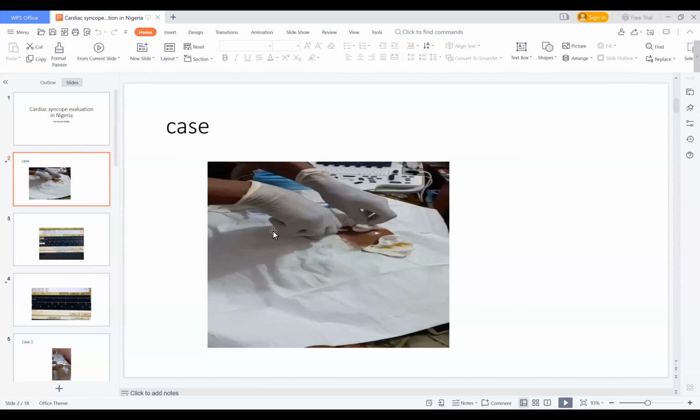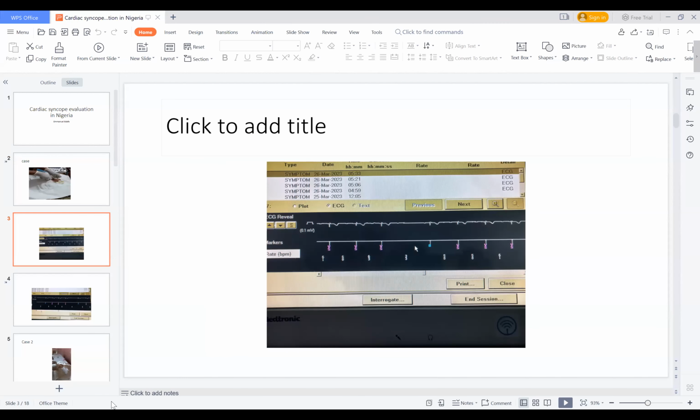Thank you very much. Yeah, so I think patient education is really important in this. The device will only store the last few automatic recordings, and for the Medtronic device, it stores the last 3 symptom recordings and overwrites the oldest episodes. It has a limited amount of memory, and it doesn't have a preferential method for saving episodes. So it is very important to get patient education.